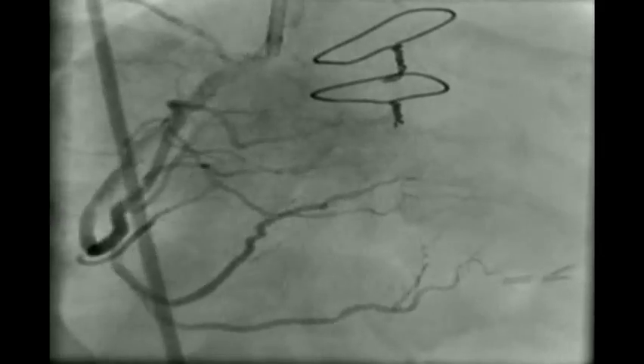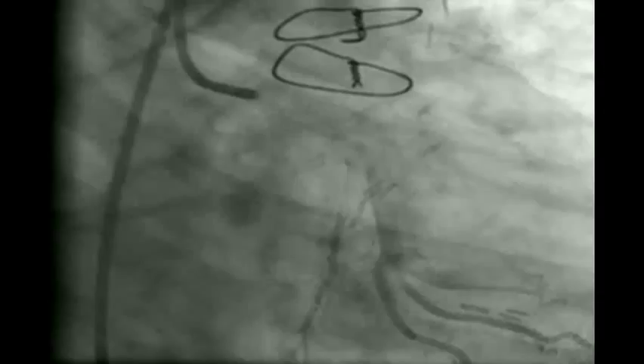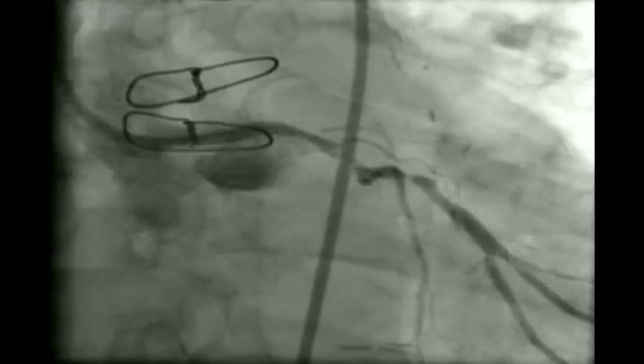We now end the RCA intervention and move to the circumflex lesions. As you see, the circumflex lesion is on a bend with around 4 lesions and a long segment involved. We take diagnostic angiograms first, then pass a guidewire and measure the lesion length, which unfortunately is more than 30 mm. We dilate the distal lesion first with the 2.5 x 12 mm non-compliant balloon at 14 to 16 atm, followed by the proximal lesion also at 16 atm.